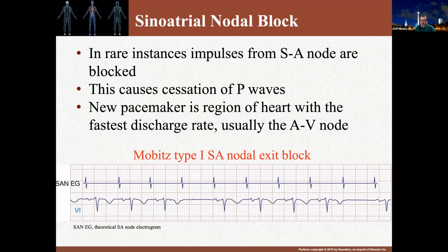You should expect a significant drop in cardiac output because of this condition. P waves, PR intervals, and QRS complexes are normal, except for the rhythm, which can become irregular.